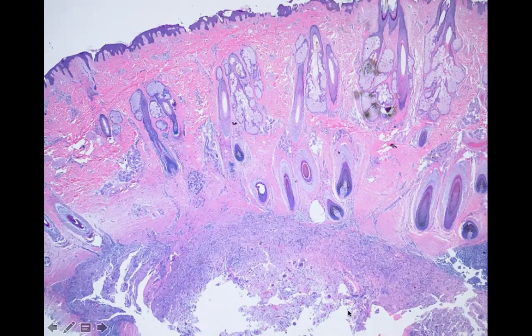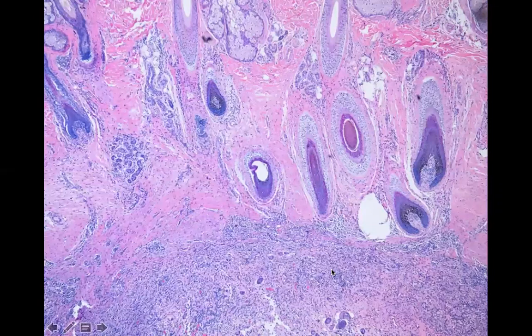People with dissecting cellulitis, similar to the people with other conditions in the follicular occlusion triad, have a problem with producing too much inflammation and shutting down that inflammation. So you get overproduction of granulation tissue, and the process is very deep, all the way down below the follicles, and then it slides around side to side, and you can get this very boggy look beneath almost normal-appearing skin in areas, and that is dissecting cellulitis. Okay, below the level of the follicles, you can see it's a little bit fibrotic. Here are granulomas with your giant cells, mixed inflammation.